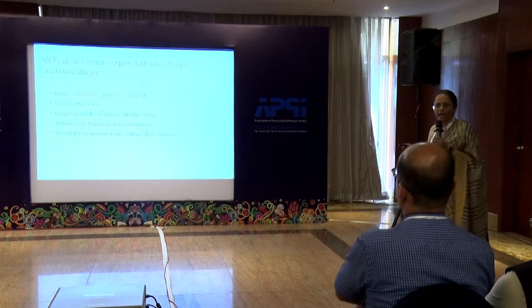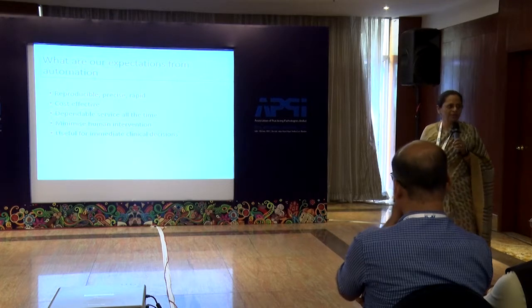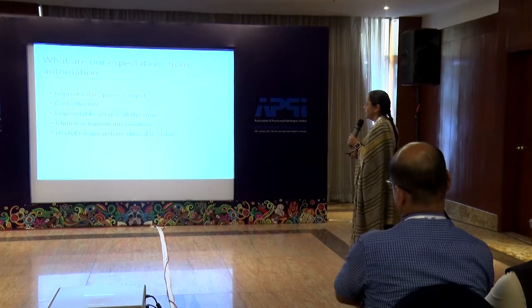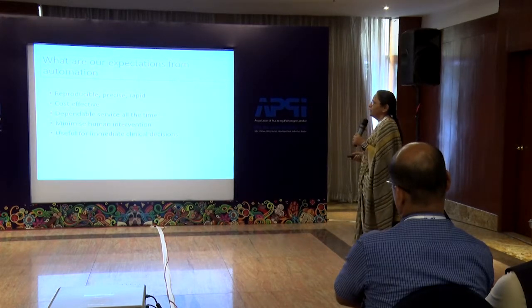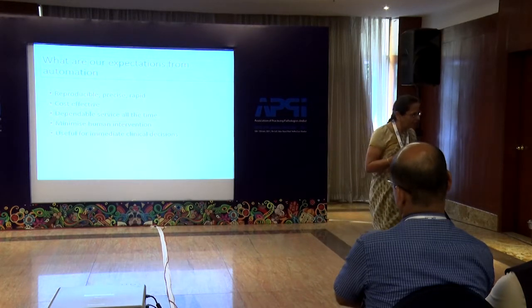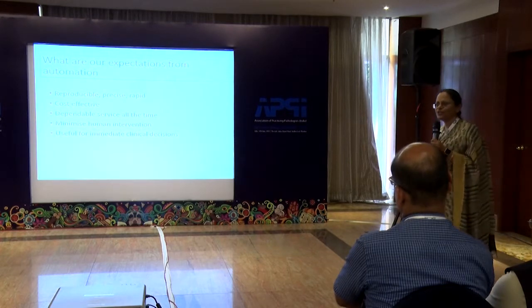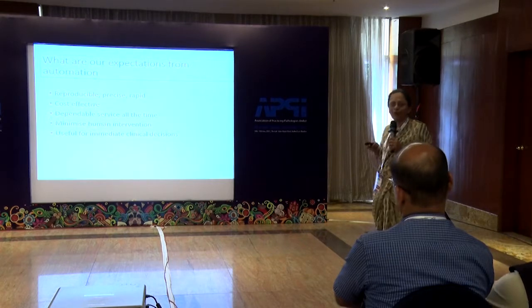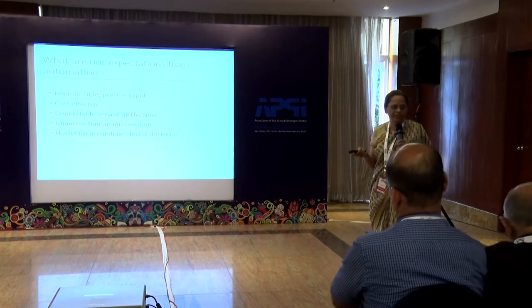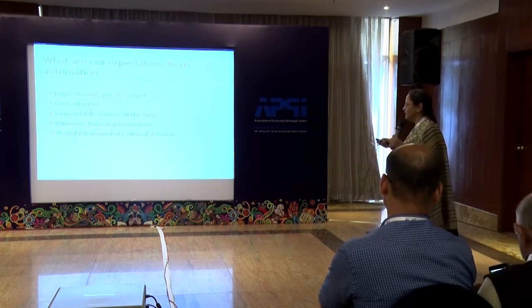So we need to have methods that are cost effective. Whatever instrumentation or methodology we choose in our laboratory definitely has this component in its decision making. We need to look at that. And very important, maybe we bought an instrument, maybe the reagents are quite easily available, maybe they are not very expensive too, but if your instrument servicing is not attended to when you need it, definitely you are not going to back that kind of instrumentation. You need a backup not only of your instrument but also for the servicing.